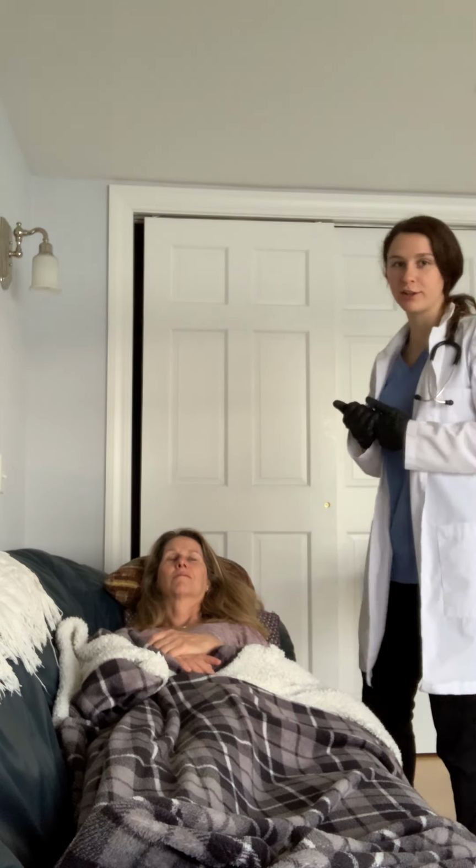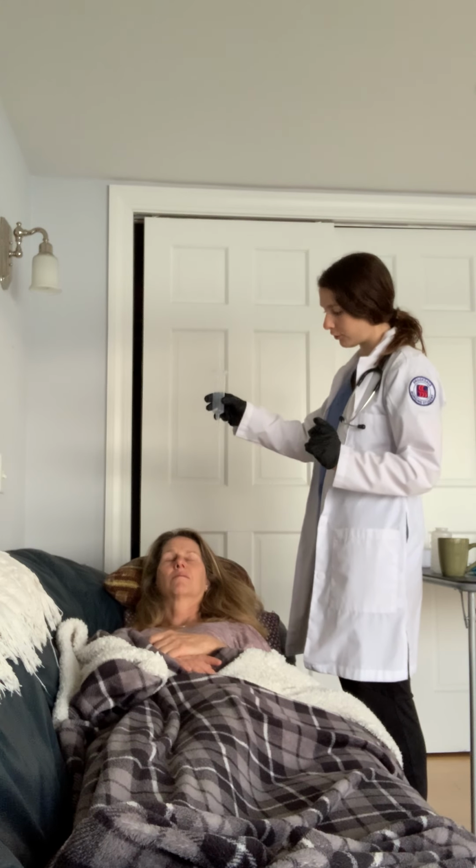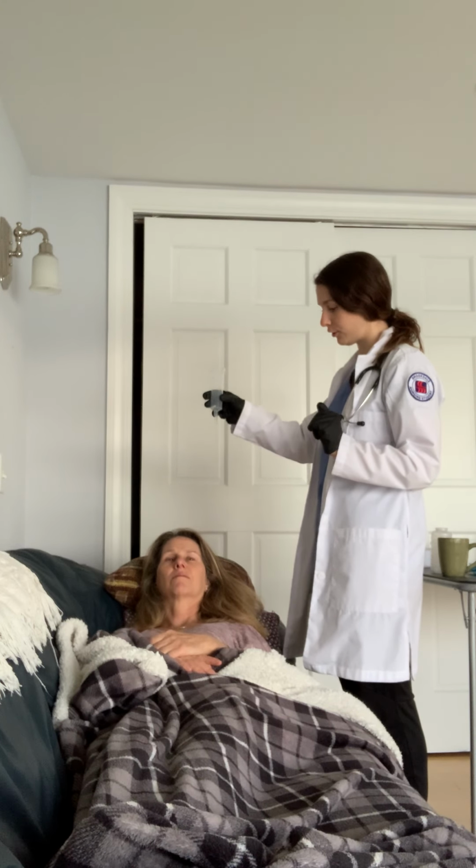So after you aspirate, you want to make sure that you reconnect the tube and get some tap water and flush it with about 50 to 100 milliliters of tap water, depending on where you work. Make sure that there's no occlusions when it's running down. Hold the syringe about 18 inches above the insertion site. That'll make sure it doesn't go too fast or too slow. So I see that the water went down fine. There's no occlusions. The line is nice and patent.